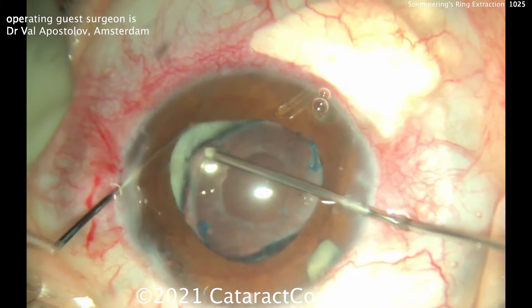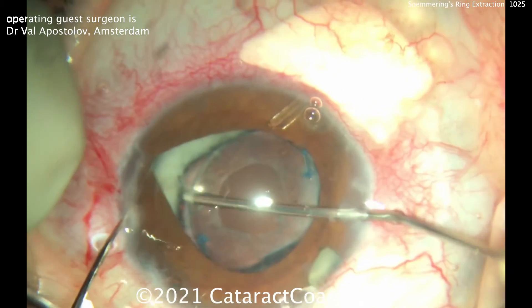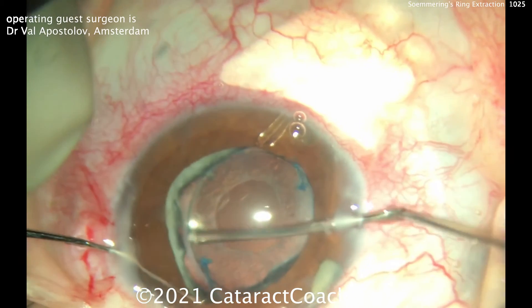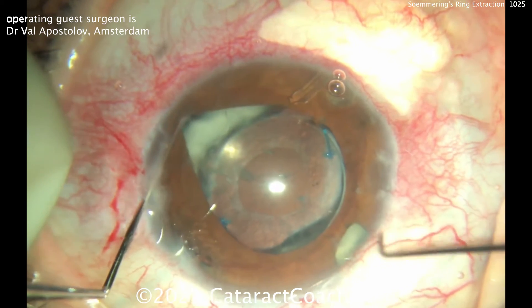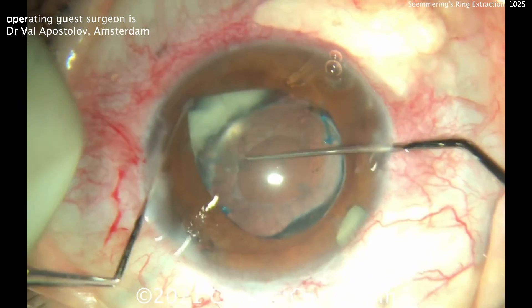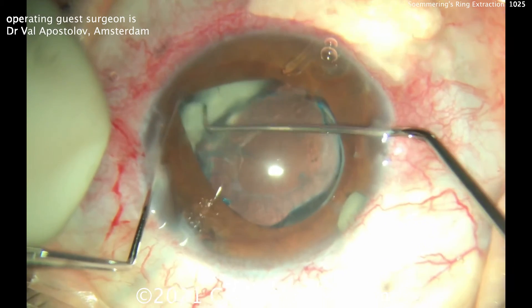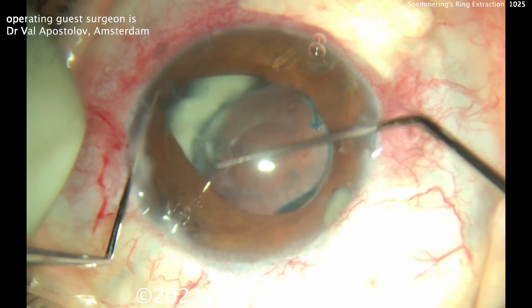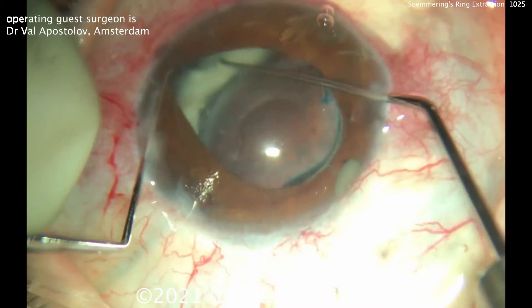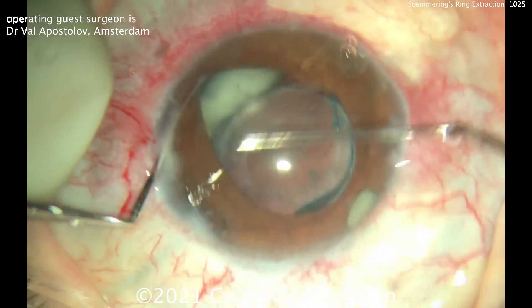Here's the patient — he has to go back inside the eye for glaucoma surgery, but while he's there, he notices a huge Soemmering's Ring. Using a bimanual approach, he's going to dissect it free. This is a 360-degree ring. The rhexis is a little on the small side from the original surgery done many years prior, and there's probably some capsule contraction as well.